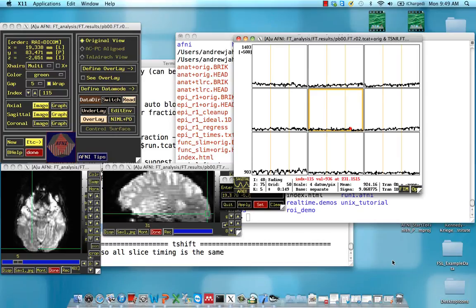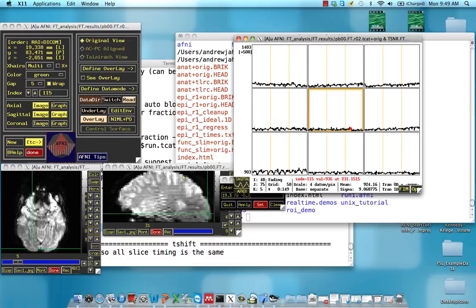The next block in our script is something called t-shifting, or slice time correction. The idea behind this is we have a series of slices, usually going from bottom to the top, and they're all acquired at slightly different times.